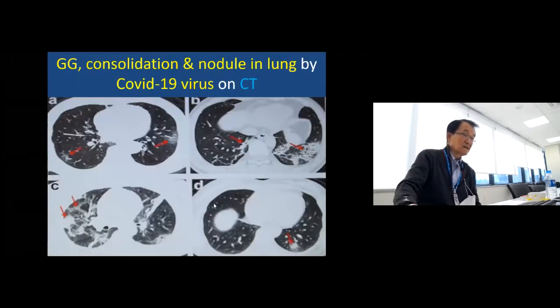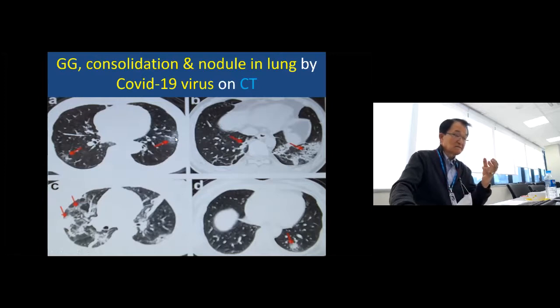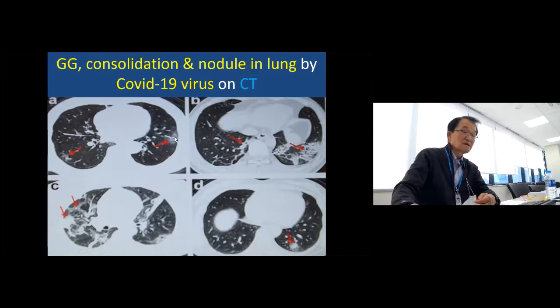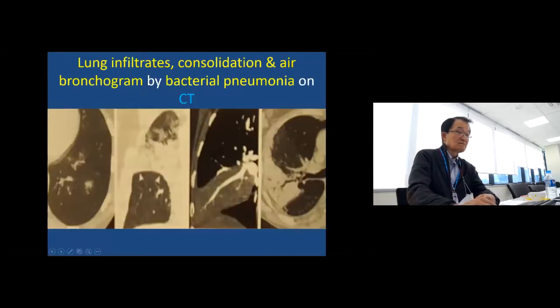And in the lung, the so-called ground glass appearance is a haziness, alveolar. Alveoli need air exchange, so they should be dark. But if there's inflammation or infection, it blocks air exchange. So it's either edema or whatever, and it shows this kind of ground glass appearance, haziness, alveolar densities, and mostly peripheral. That's a typical finding of alveolitis.